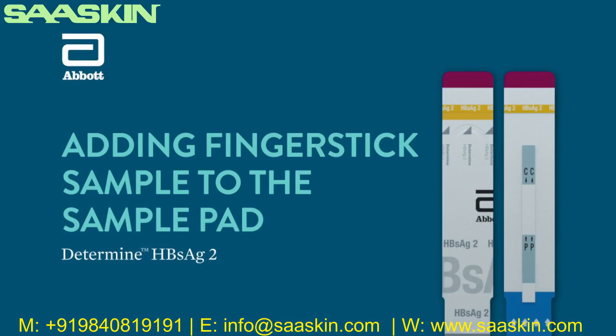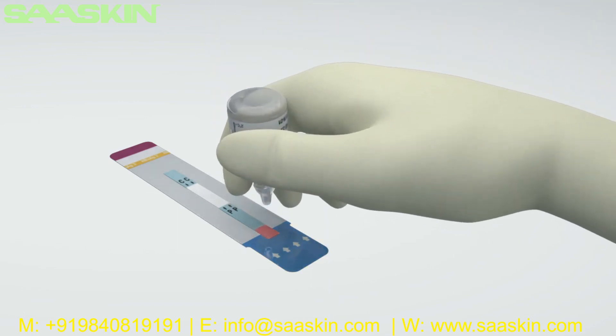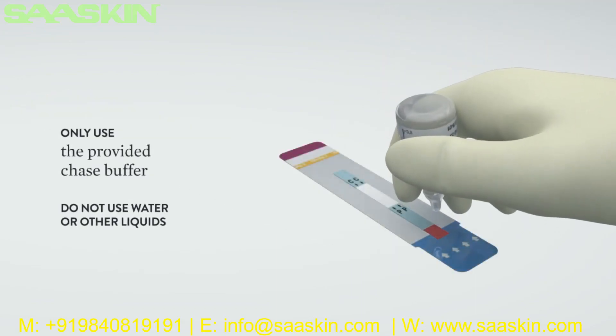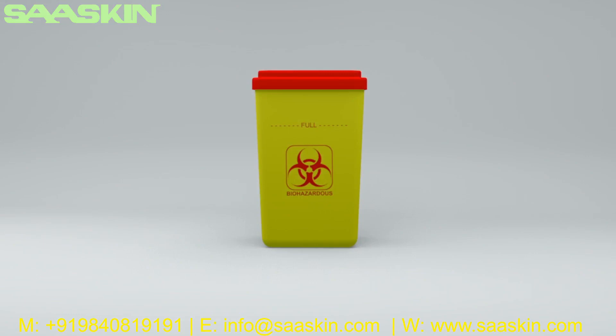Adding the finger stick sample to the sample pad: Touch the tip of the capillary tube containing the blood sample to the sample pad vertically and expel all of the contents. Avoid air bubbles. Wait until the blood is transferred from the capillary tube to the sample pad. When all of the blood is transferred, add one drop of chase buffer to the sample pad. Caution — do not lift the capillary tube from the sample pad before all of the blood has been transferred, as a bubble may form which will prevent the complete transfer of sample. Only the liquid provided in the chase buffer bottle should be used — do not use water or other liquids. Read the test result between 15 and 30 minutes after the addition of the blood. Do not read the results after 30 minutes. Discard the used capillary tube, test units, and any other test material into a biohazard waste container.